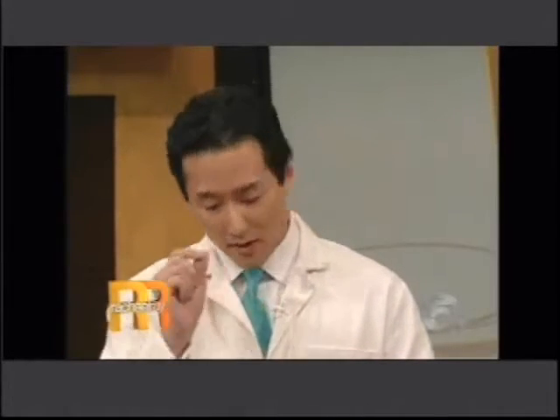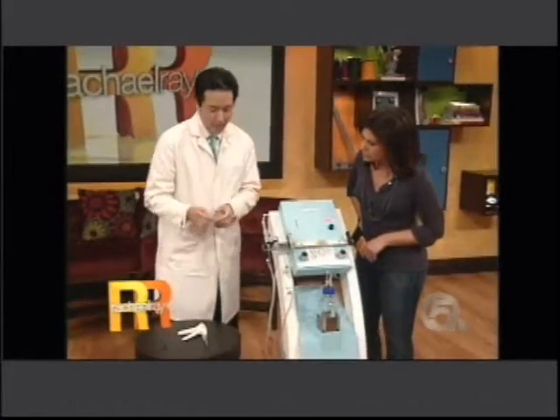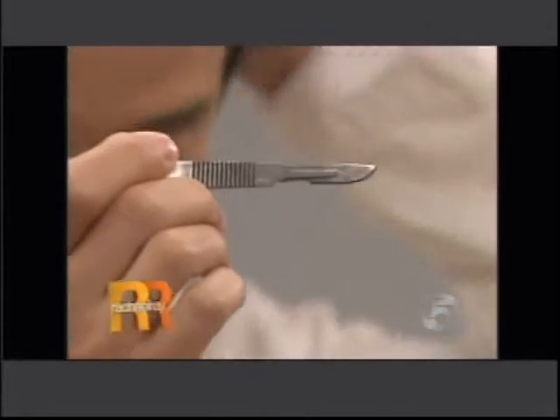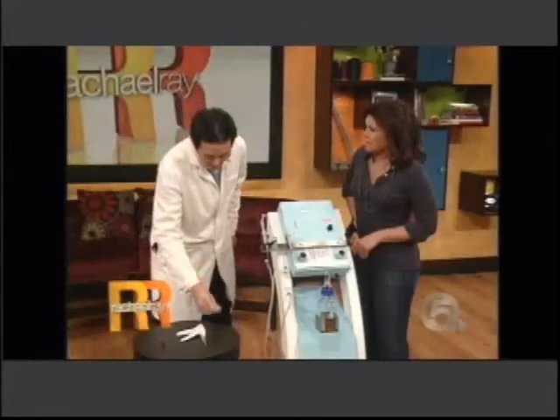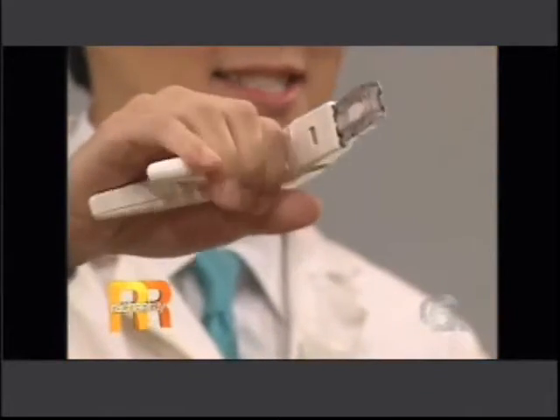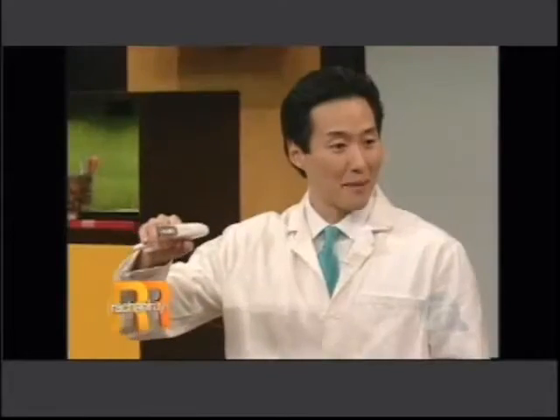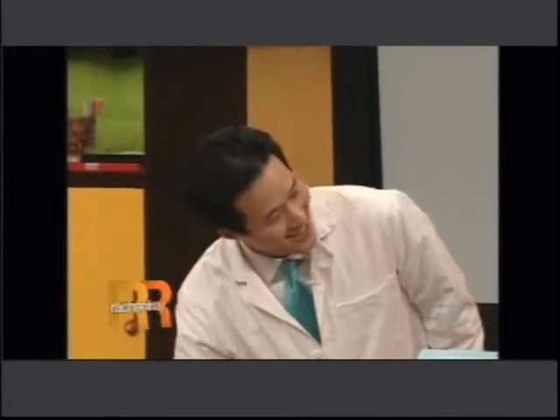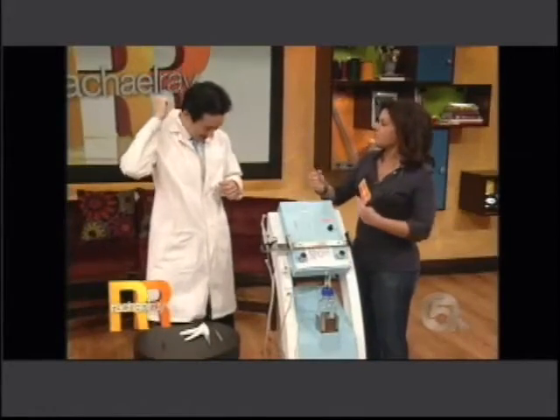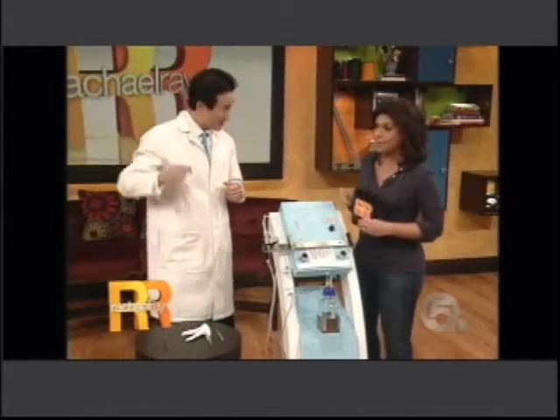So a traditional hair transplant surgery entails 5 steps. First step is, as a surgeon, I would take a big scalpel like this and literally cut a strip of skin off the back of a person's head. Second step is I would take a stapler like this, a staple gun, and staple that scalp back together. Are you serious? Yes. You just take a staple gun and staple the person's head back, like a Frankenstein-ish type of thing.